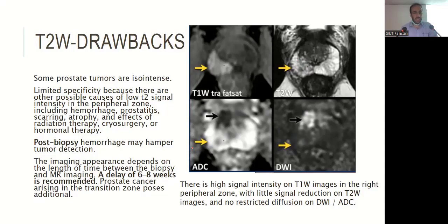So post-biopsy hemorrhage may hamper tumor detection. The image appearance depends on the length of time between the biopsy and MR imaging; a delay of at least 6 to 8 weeks is recommended. And prostate cancer arising in the transition zone poses additional challenges.